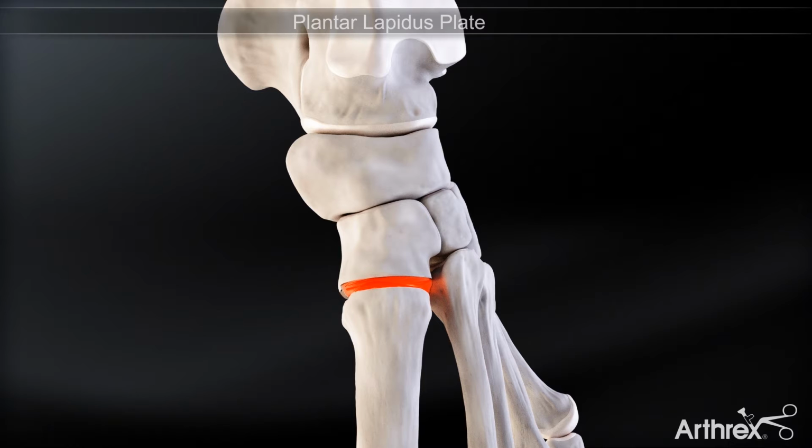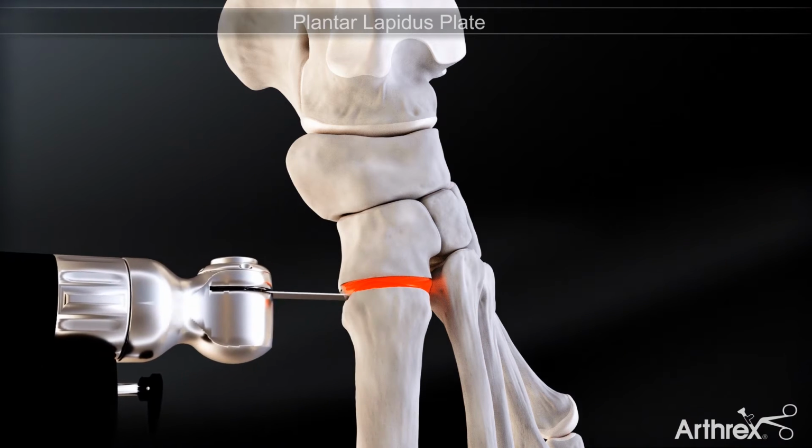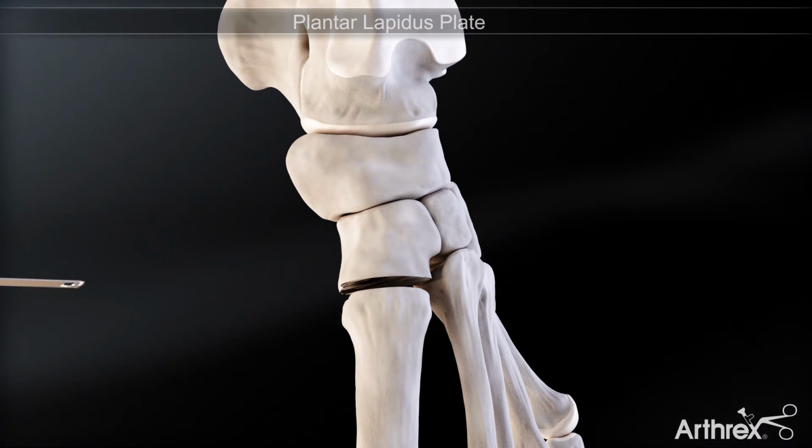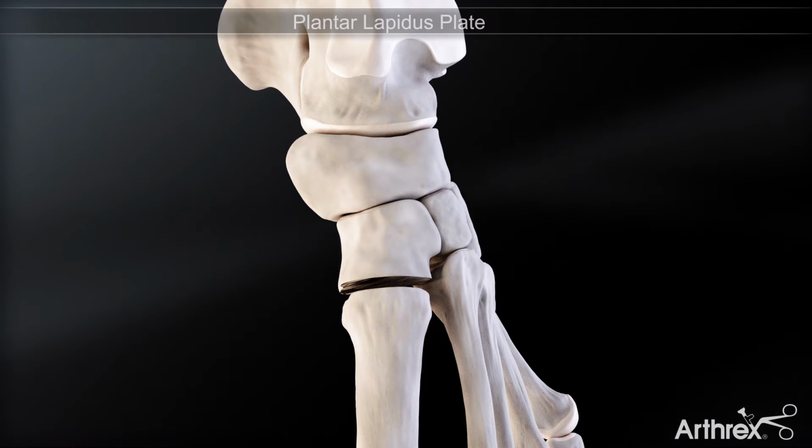Additional incisions can be placed distally to access the medial aspect of the first metatarsal phalangeal joint, as well as the lateral aspect of the joint if a soft tissue release is to be done. At this time, the first tarsometatarsal articulation is prepared by removing the cartilage and preparing the joint for a standard arthrodesis.